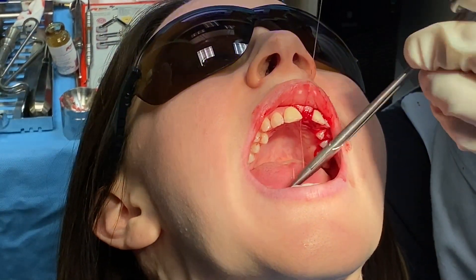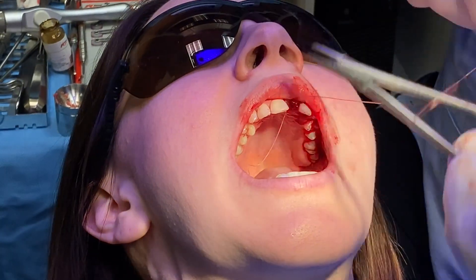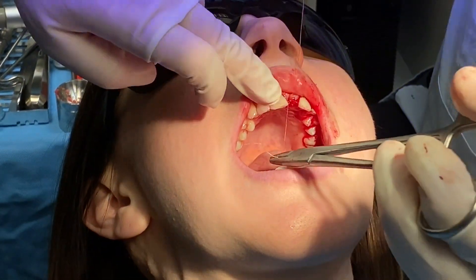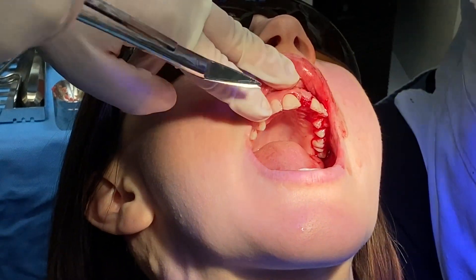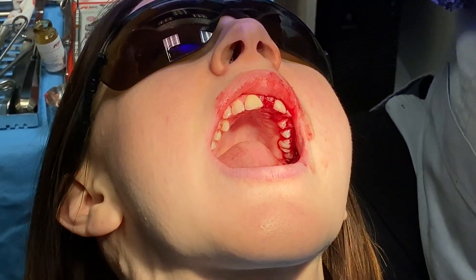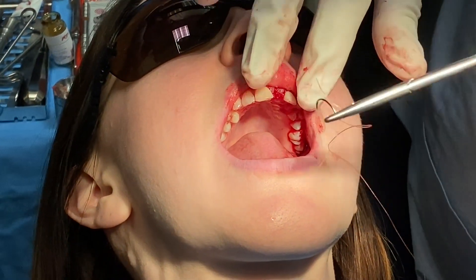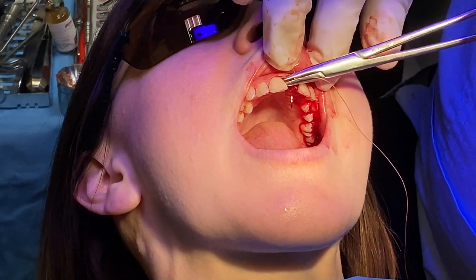It's pretty straightforward and very quick and easy. The beauty of it is you can put the clip in the patient's mouth, take the x-ray, and then do the surgery the same day. This is nice because the patient does not have to come back to make a template and do all of that, because I do about 100% of my cases guided.